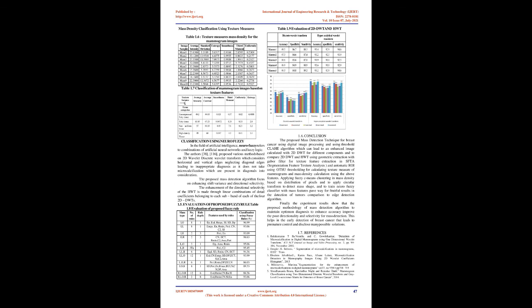Applying fuzzy C-means clustering in mass density based on distribution of pixels, and applying circular transform to detect mass shape, and training a neurofuzzy classifier with mass features pave the way for fruitful results in the detection of tumors.